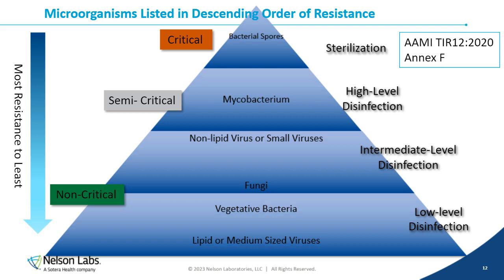In addition, I've added where the sterilization and disinfections fall in line in relation to the microorganisms, as well as the device classification: critical, semi-critical, and non-critical.